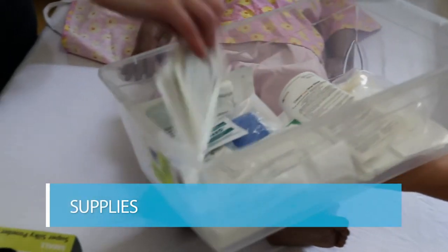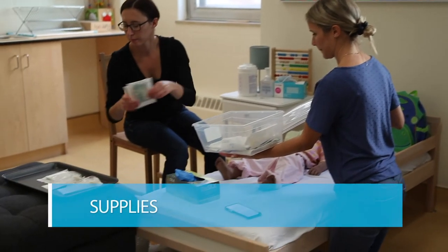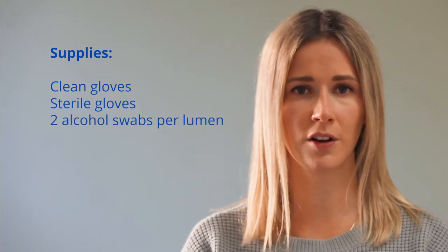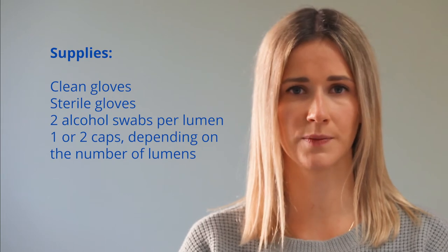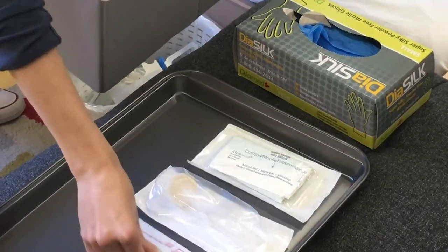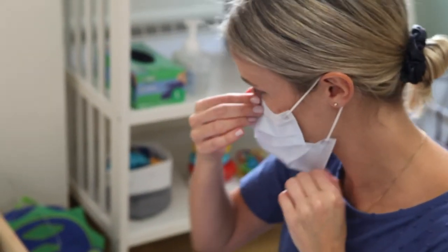Gather your supplies and place them on the clean general aseptic field. You will need clean gloves, sterile gloves, two alcohol swabs per lumen, and one or two caps depending on the number of lumens. Keep all supplies in their package until you are ready to use them — this is known as the micro critical aseptic fields. After gathering your supplies, perform hand hygiene, then put on your mask. Everyone in the room should put on a mask.